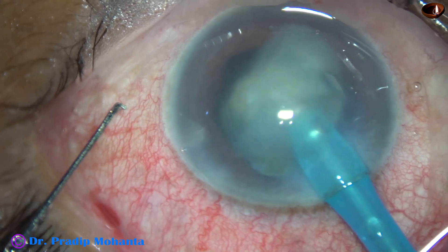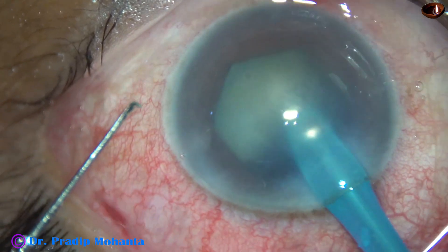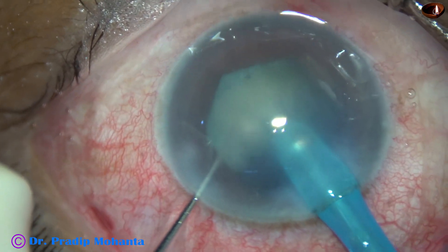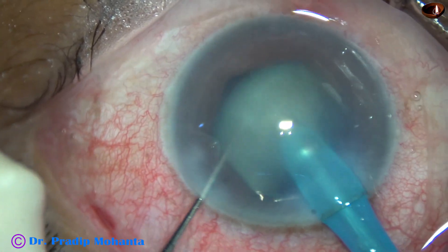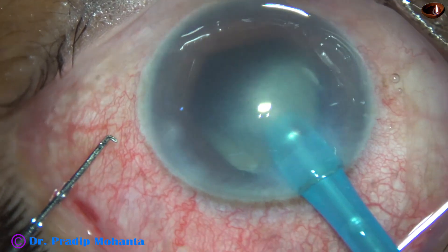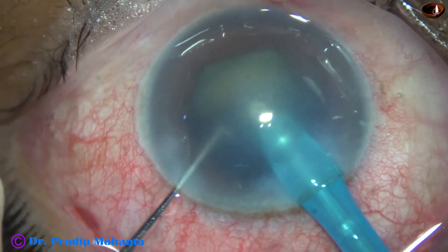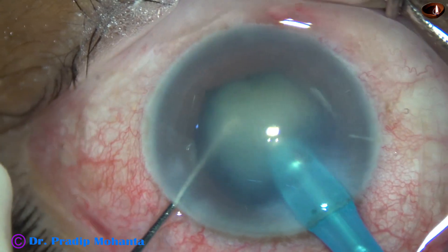Very hazy cornea. I am placing the tip at the central part. I have removed the chopper. Now I am trying to hold the nucleus — good, hold it, good, chop it. As I remove the chopper, the leakage through the side port stops and followability increases.